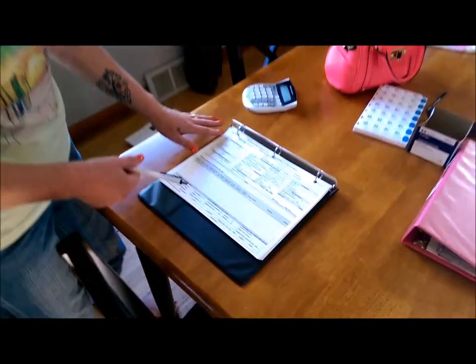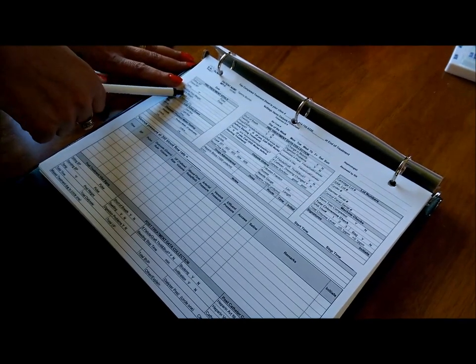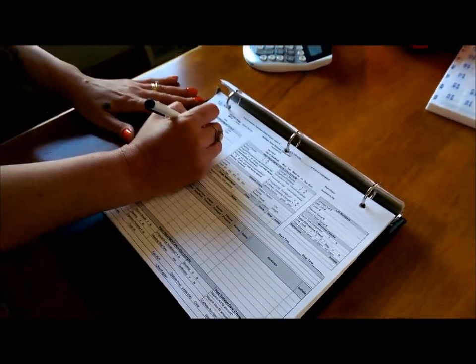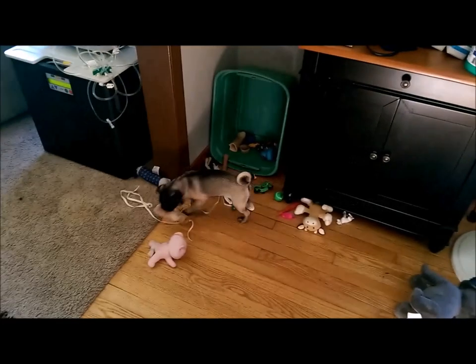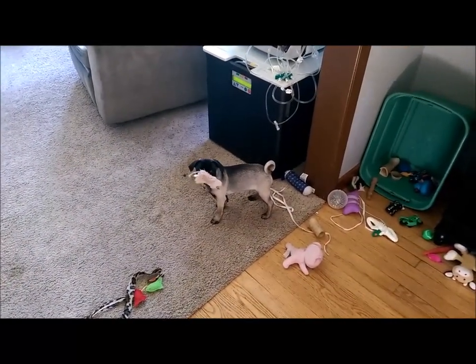Every time you do a treatment you fill out a flow sheet — it keeps track of all of your information and helps you figure out your weight and how much fluid you need to remove. I haven't weighed myself yet, but my dry weight — which is your weight after dialysis — is 56 kilos. We also found it helps if you have a puppy playing close by making a lot of noise interrupting your video.